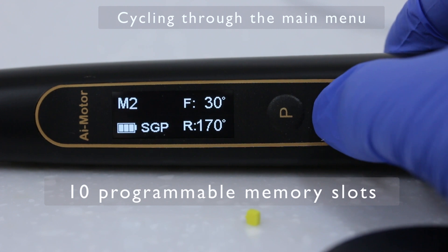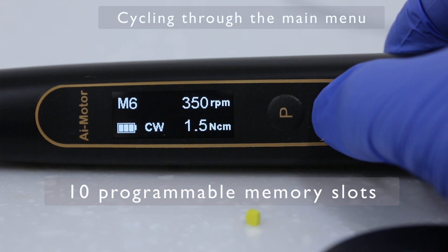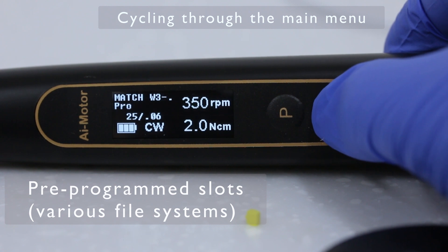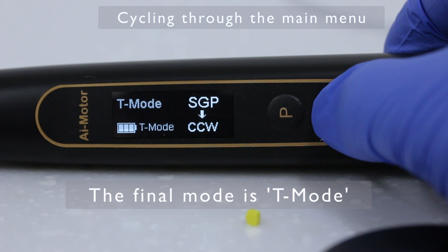When the handpiece is turned on, there is a main menu that can be navigated by the plus and minus buttons. There are 10 programmable memory slots, some preset file systems, and the final option is T-Mode — all of which will be reviewed here today.